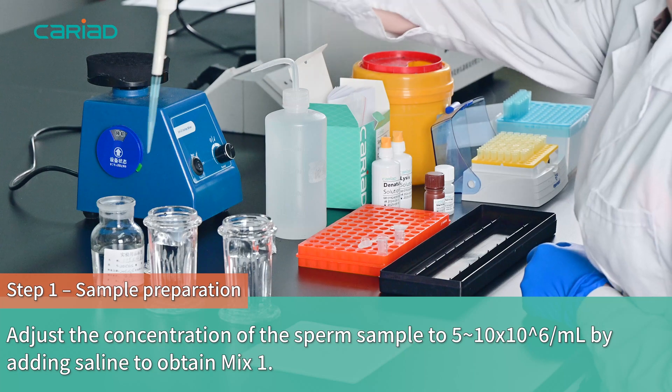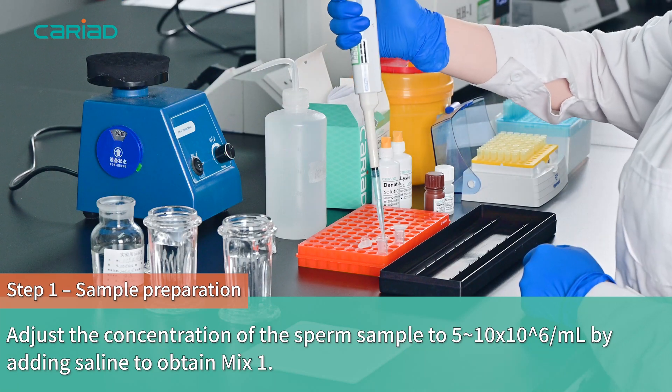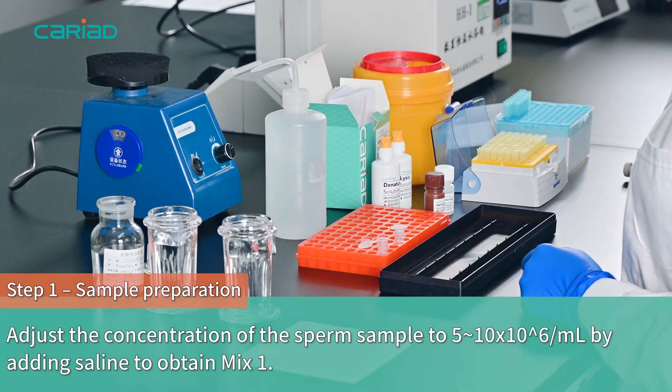Step 1 - Sample Preparation. Adjust the concentration of the sperm sample to 5 to 10 million per milliliter by adding saline to obtain Mix 1.